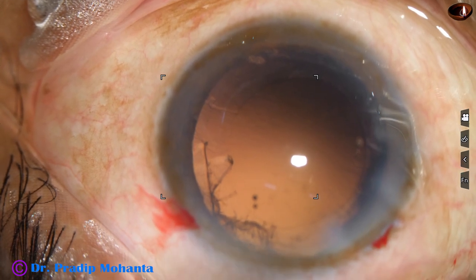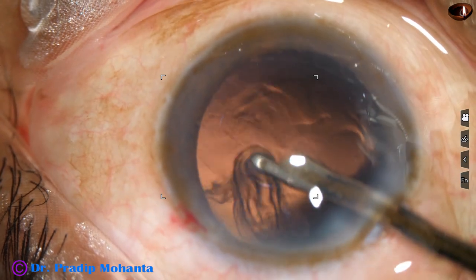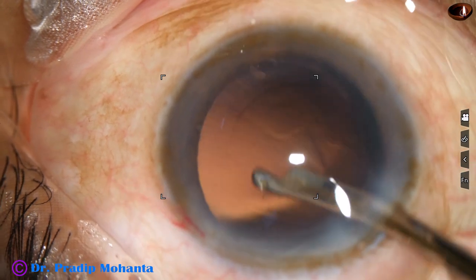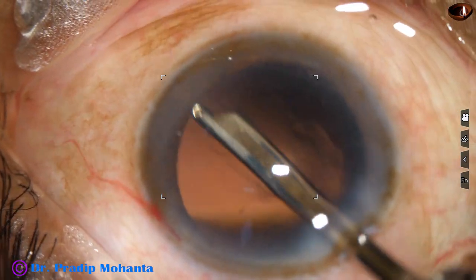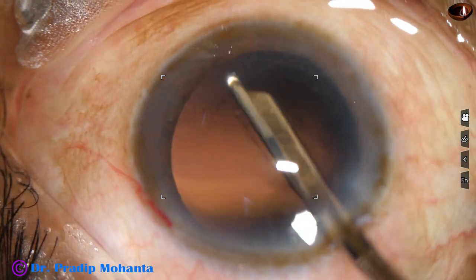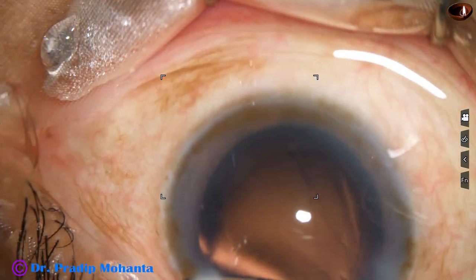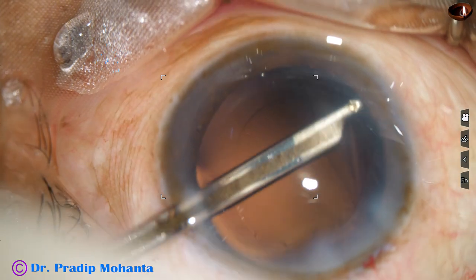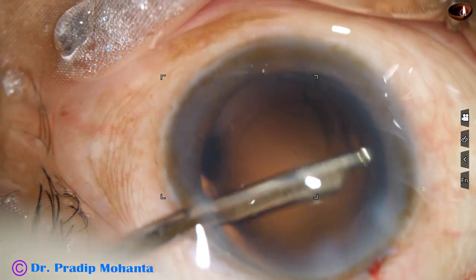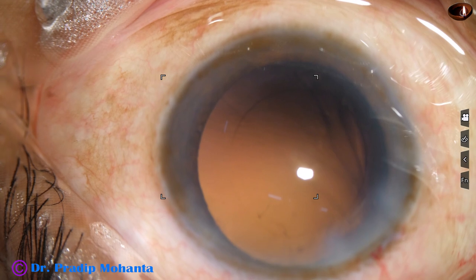Visco is again injected to fill the anterior chamber and the cortex is removed. Some fibers were there at 6 o'clock and 7 o'clock and they are removed. In this case we have only one side port, so I am using a Simcoe cannula 23 gauge to remove the cortex.